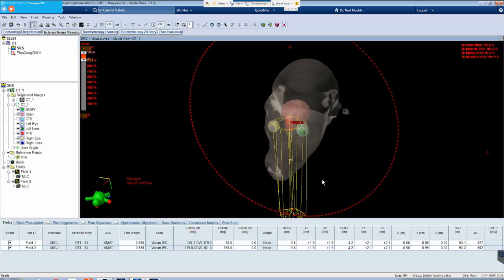And it also allows us to break the dose away from these normal structures so that we don't have as much dose coming through in this area where it would be coming through the eye. The machine can decide to scale back the radiation dose and maybe push a little bit harder in some of these areas where there's not a critical normal structure.